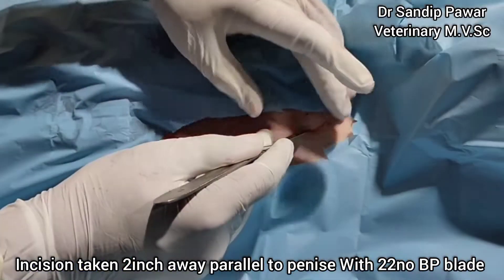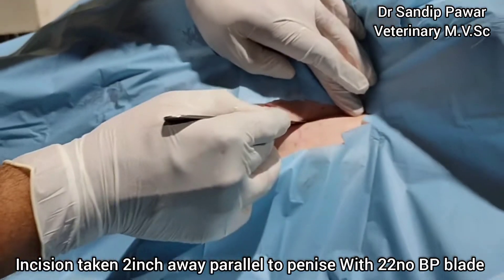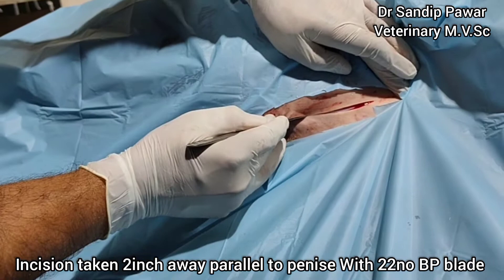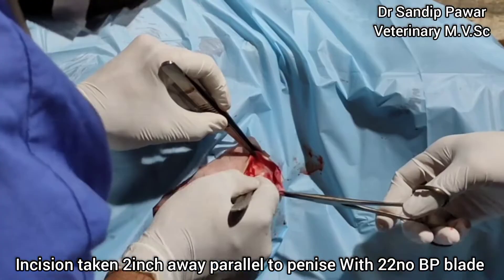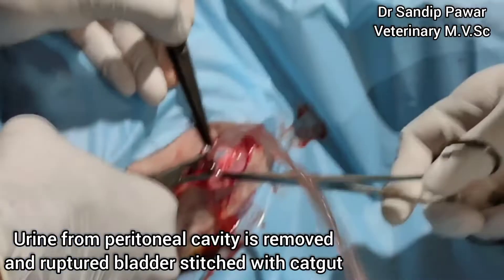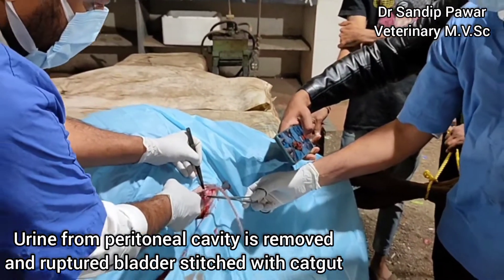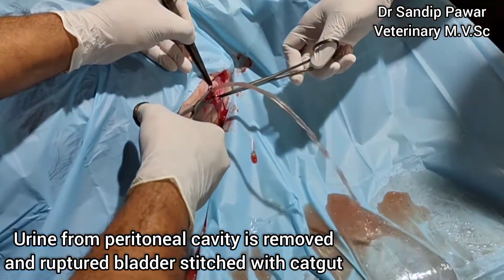Using a 22 number BP blade, an incision was made 2 inches away and parallel to the penis. After the incision, the urine was removed from the peritoneal cavity, and the ruptured urinary bladder was stitched with chromic cat gut.